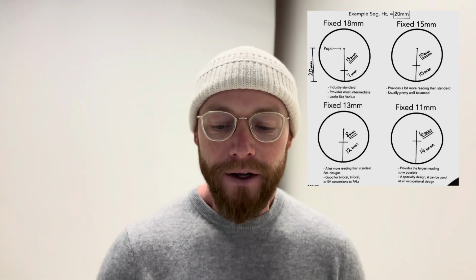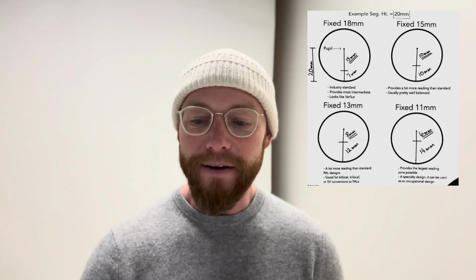So the first design in a progressive lens, fixed 18, is kind of the industry standard. And this provides the most intermediate, so it's kind of built for our digital world with a very wide intermediate, which would be your computer distance or conversation distance. And it's going to be more the industry standard. Then you have the fixed 15, which is a bit more reading than your standard. So if you are a person who wants a little bit more room in your reading, then we're going to change that to a fixed 15.